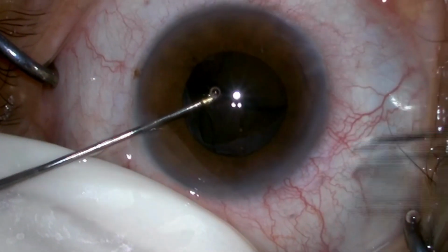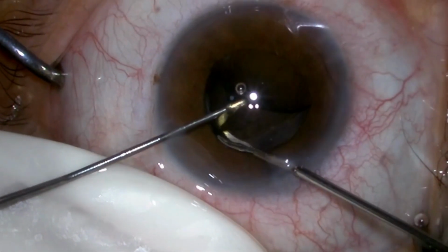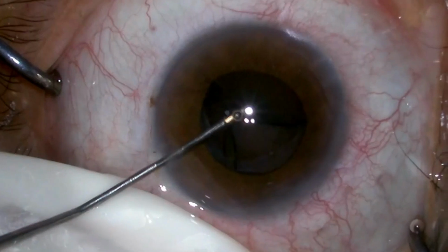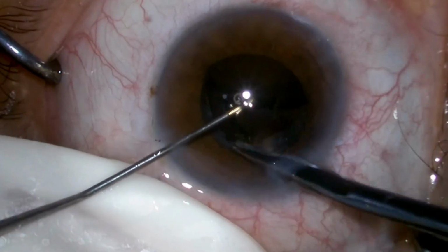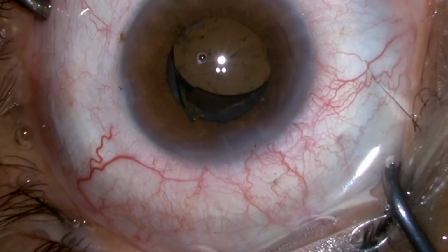So now we have decided that we will cut this haptic, because if we try to pull it out too much, the bag might get damaged. Now we have cut the haptic.